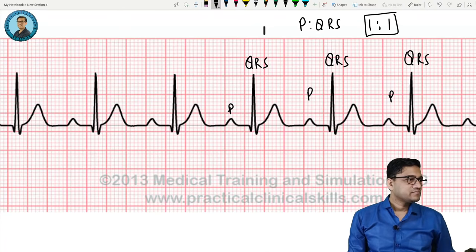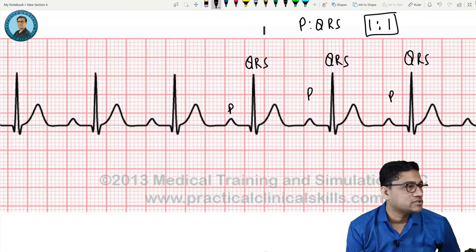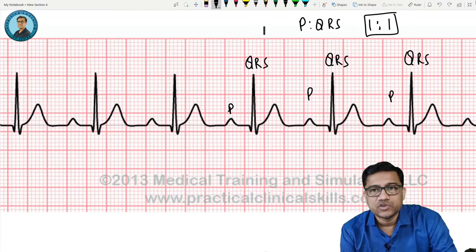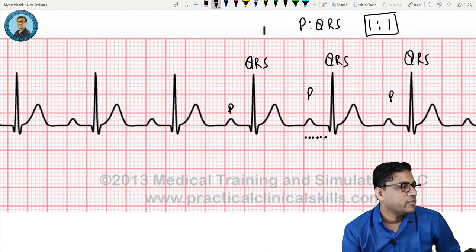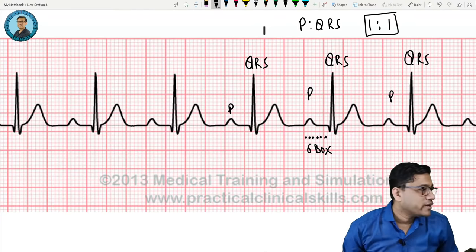So now let's count the number of boxes. Can we count? See, one box. I'll write like this. One box, two box, three box, four, five, six. There are how many boxes? Six boxes. Just see here. Clear?